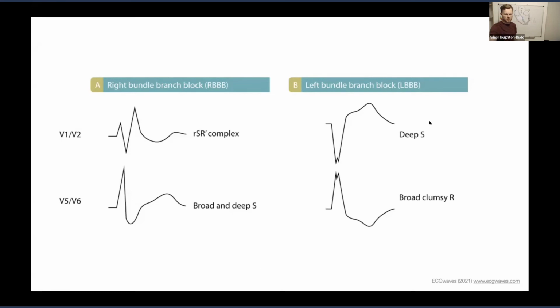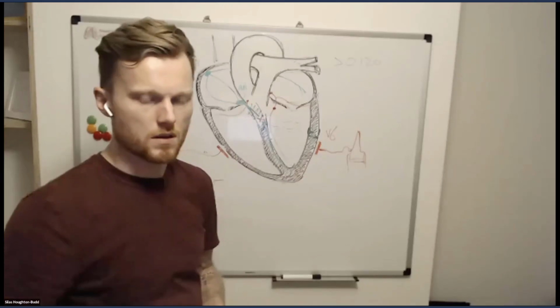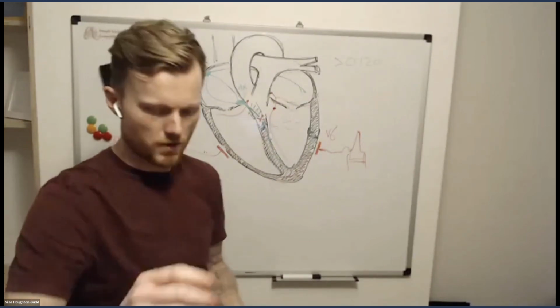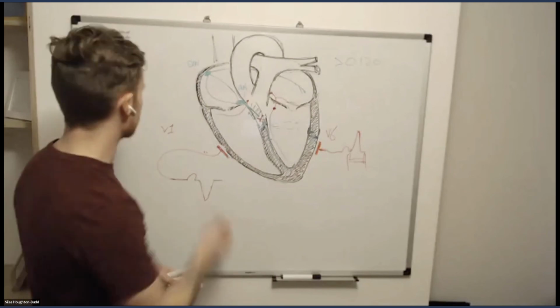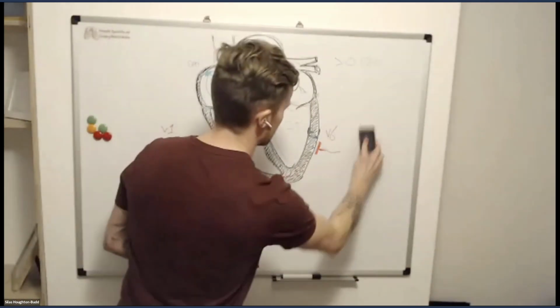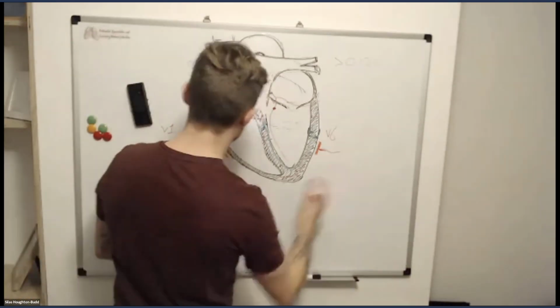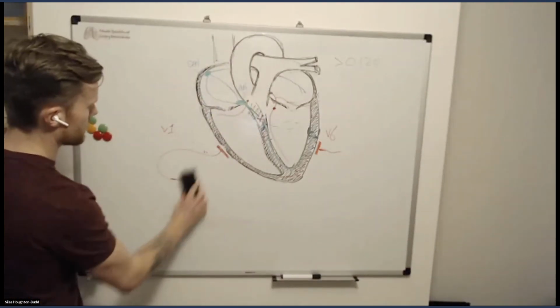And I'll just, if I can stop screen sharing, I'll just draw that quickly for clarity. But essentially, if we draw that pattern, I'll do V1 here.